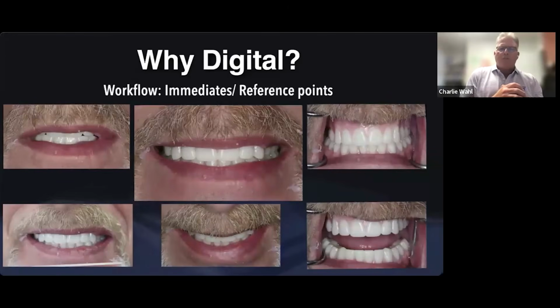But in general, occlusal plane, all of those things are pretty close, and we can start to evaluate him as he heals. As we look at this setup, number 11 is kind of flared out. Maybe the canines are a little bit long, occlusal plane slightly canted. There are little nuances. Buccal corridor on the left side is not as good as the right side. But this isn't our final denture, right?